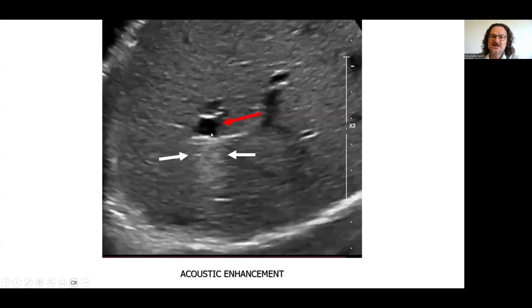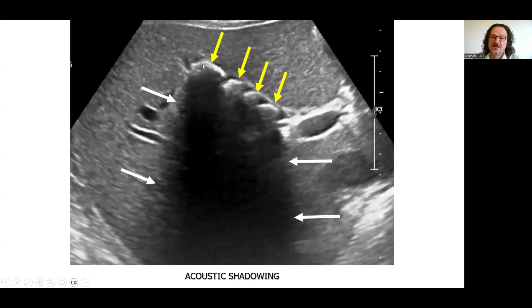This is an acoustic enhancement example — a typical cyst shows posterior acoustic enhancement. Acoustic shadowing occurs in areas where sound cannot penetrate or is totally reflected, and we can see the shadowing in the deep areas.